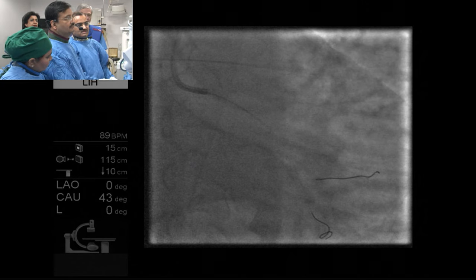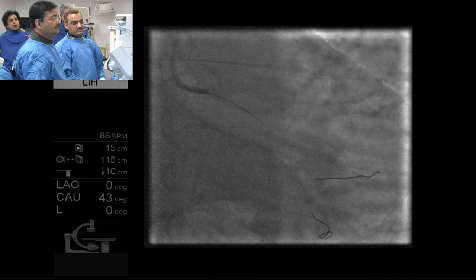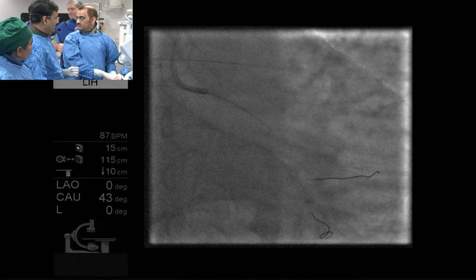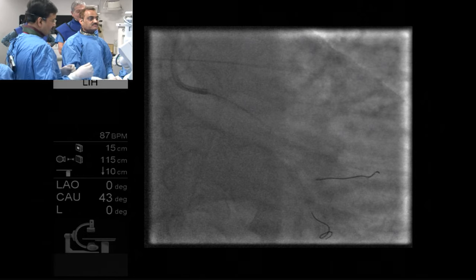So what do you guys want to do now? I think now it's going to be okay as long as I can dilate it. I would still stent from that vertical, perpendicular OM into the circ and leave the wire in the bottom branch. I think you'll get away with it nicely. Can we get to a 1.5 balloon? I think 1.5 will be okay, right? Or take longer. Whatever, 2 or 1.5 NC is fine. NC is better. If that goes, then 1.0 goes. And we can do high pressure.